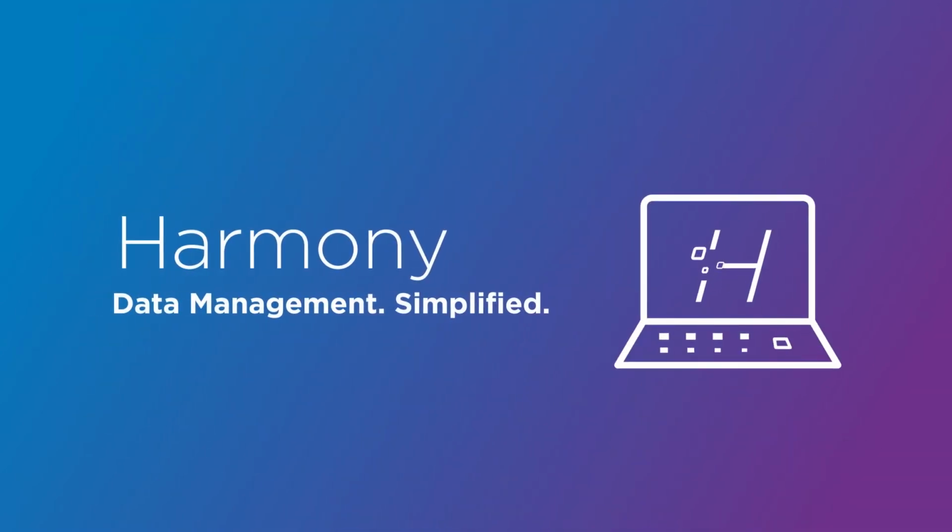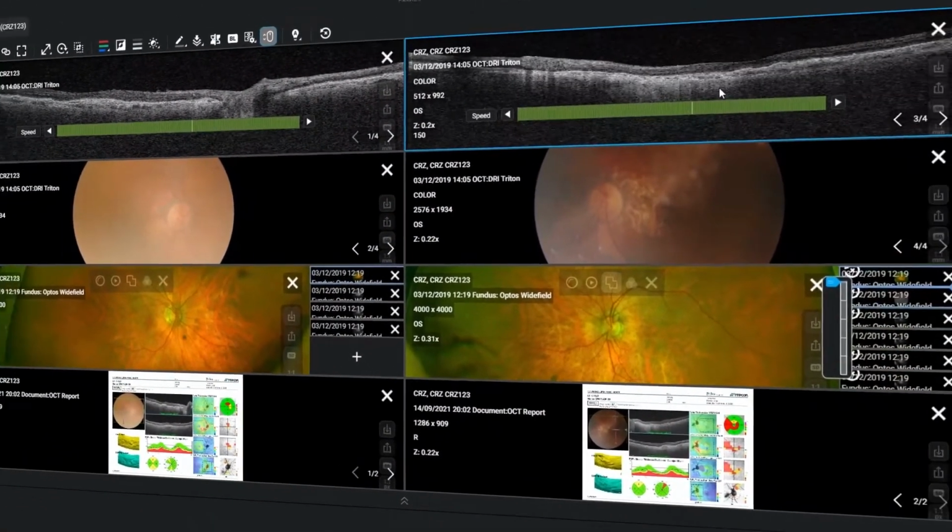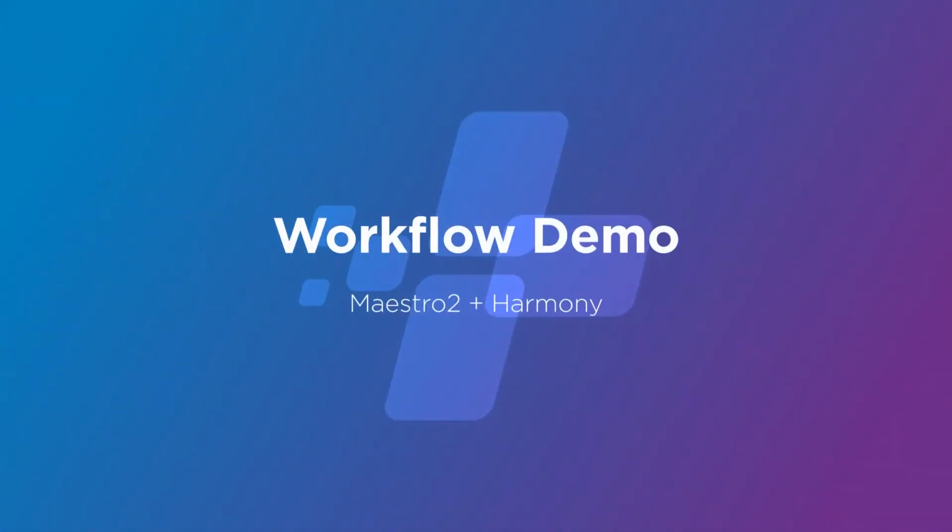Harmony is a device-agnostic, cloud-based data management solution that offers single-screen display of your diagnostic data. Let's take a look at how these technologies work together to streamline your practice workflow.